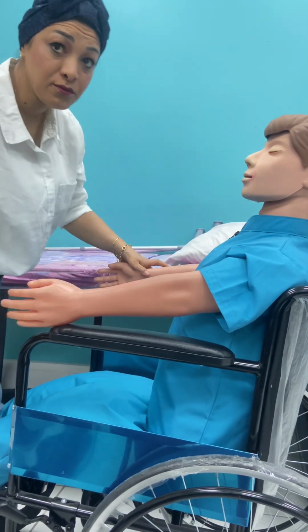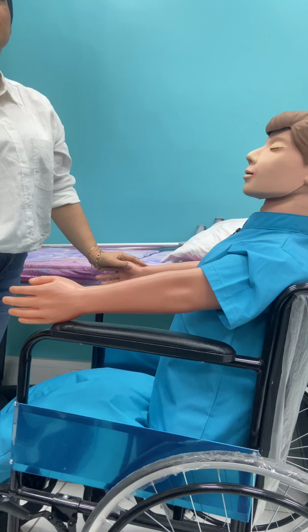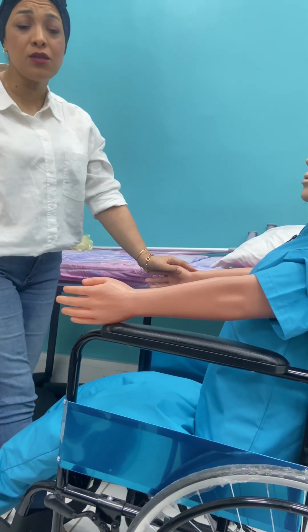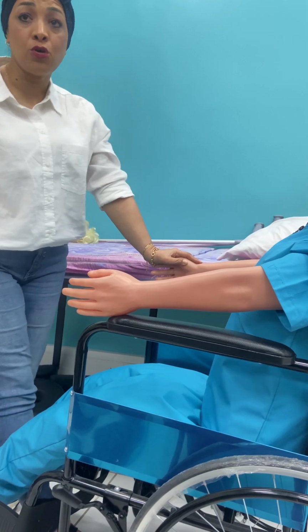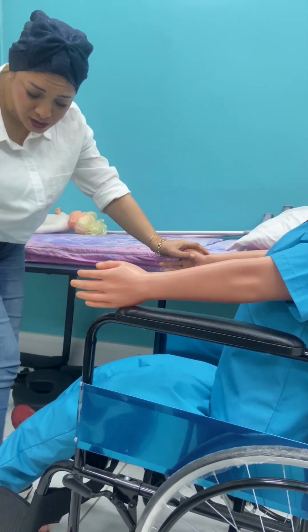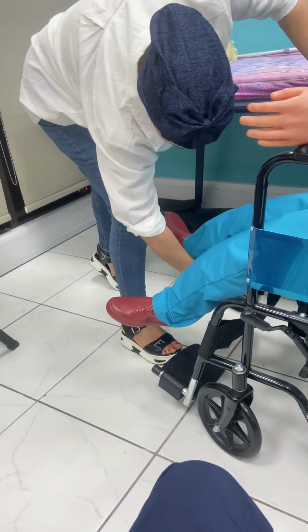If the patient is heavy, you can move left and right also. Yeah, that's what I said. You ask the patient first to cooperate. We are supposed to encourage him to move if he is able to. So you ask him just to go back left and right, and they usually do it. Otherwise, you have to assist the patient. You cannot just wait. And you help him also to rest his feet on the footrest.